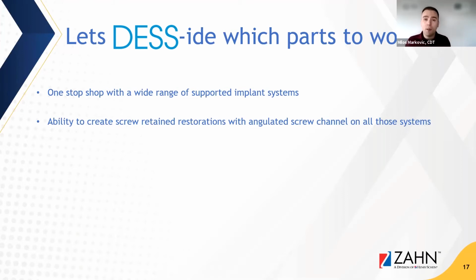If you were doing a zirconia abutment with a crown on top, you have to get a tie base, cement an abutment onto the tie base, and then cement the crown over that abutment. So you're doing two cementations with a lot of potential moving parts and a lot of potential for failure. So doing screw-retained restorations has been more of a trend that we're seeing.